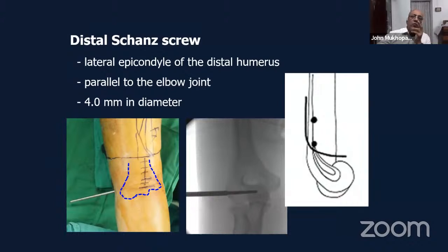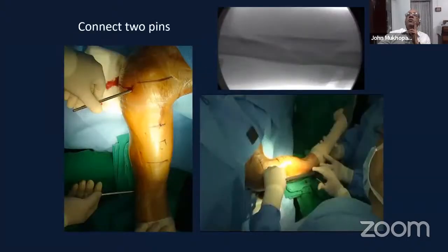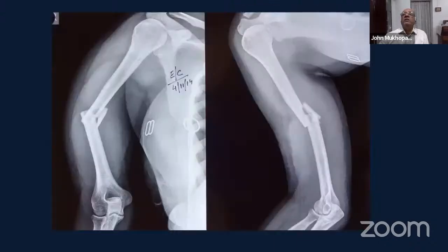And once you do that, you attach an external fixator to your Shanz screws. Okay, so you can fix that with a Shanz external fixator, connect the two pins with a rod, and that will hold things reasonably apart, reasonably in line while you can do your plating. So here's a case.